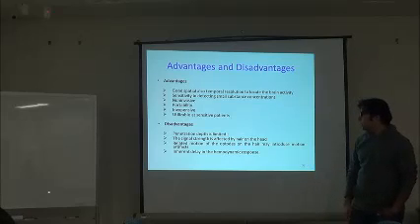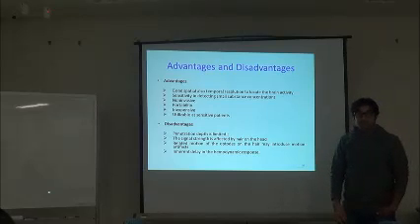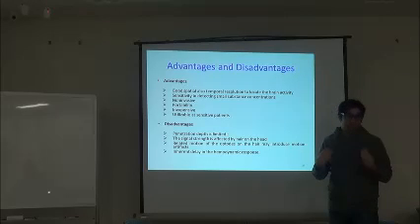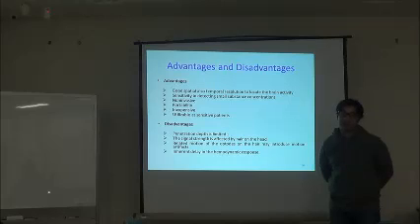And the last, and the important one, is the inherent delay in the hemodynamic response. The most relied upon response detected by fNIRS is the hemodynamic response, and it takes some time to reach its peak value after the onset of the task or activity.